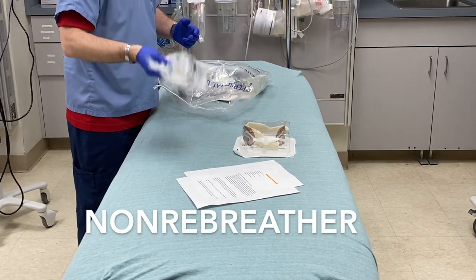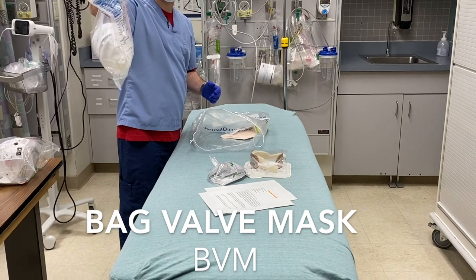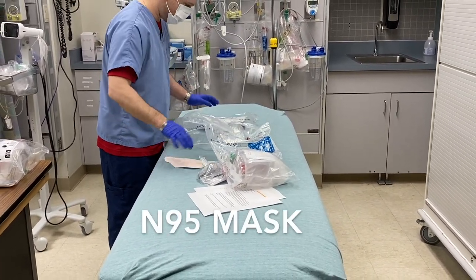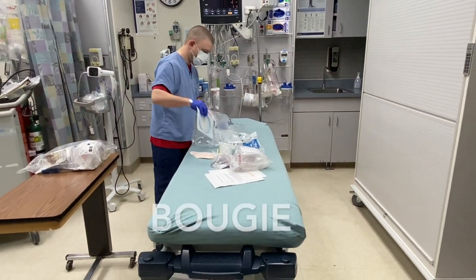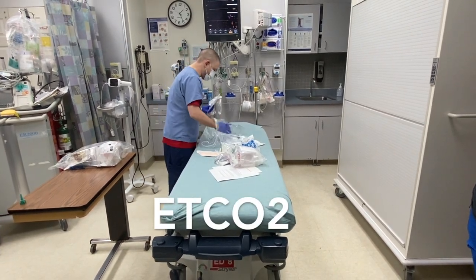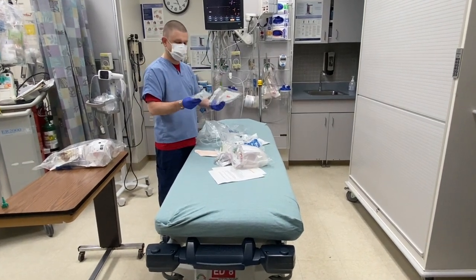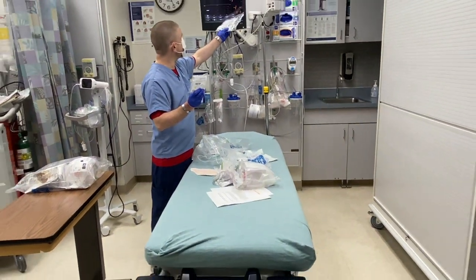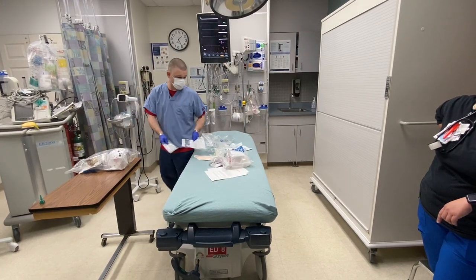You have a non-rebreather. We have a BVM with adult mask. We have an N95. We have a viral filter. We have a bougie. End tidal CO2, and there's a couple of versions of these. They're for the tube only. Don't put the nasal cannula ones in. It's just the tube only. There's a couple different versions: one that hooks up to our monitor system, and the other one for our standalone system right here.